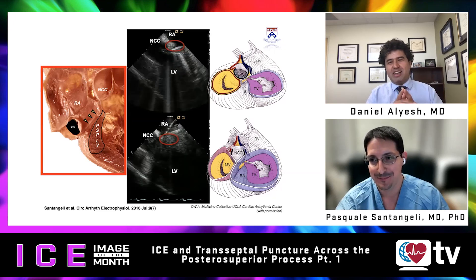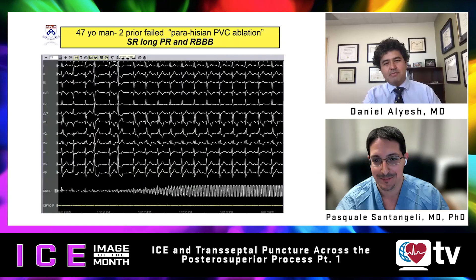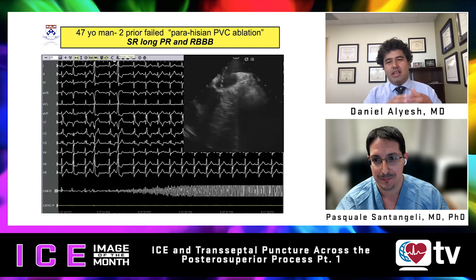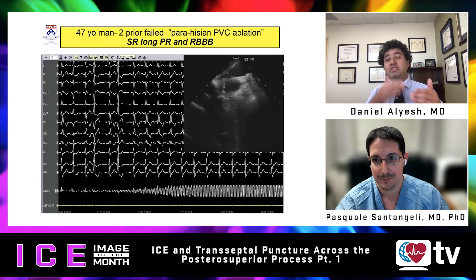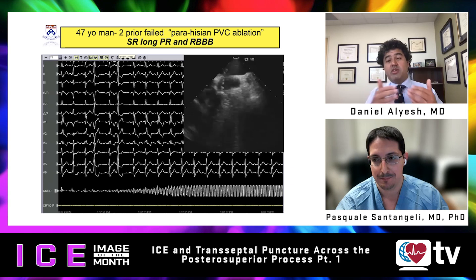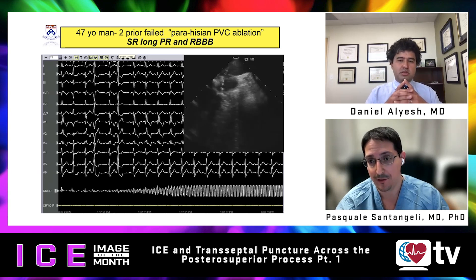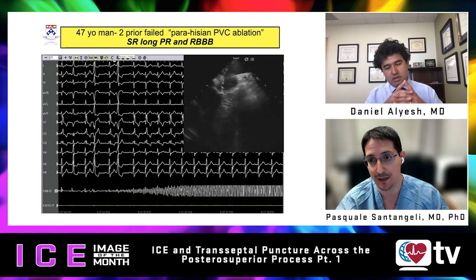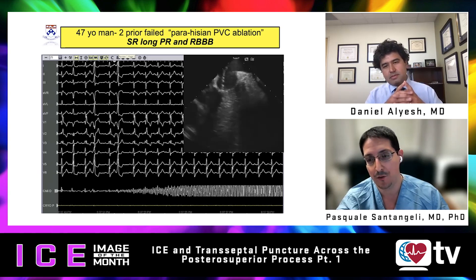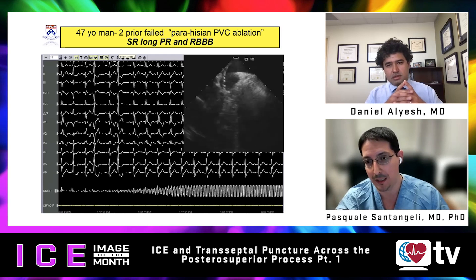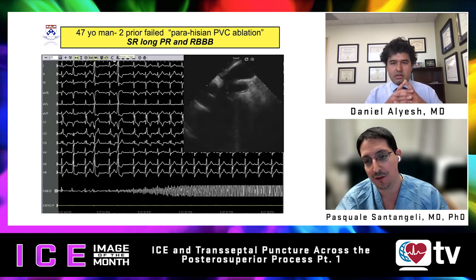In another example case, it appears the catheter is accessing the PSP from the coronary sinus, but actually it is slightly outside the coronary sinus. Occasionally during the heartbeat, the valve at the ostium of the coronary sinus comes into view, confirming the catheter is just outside it.